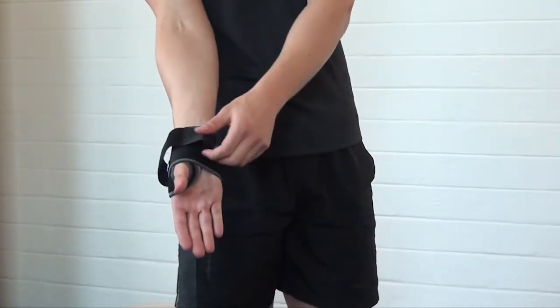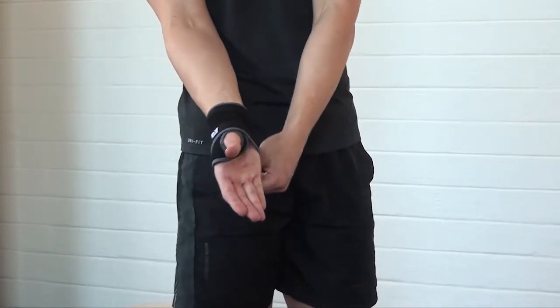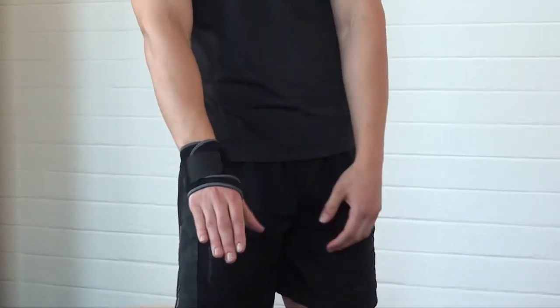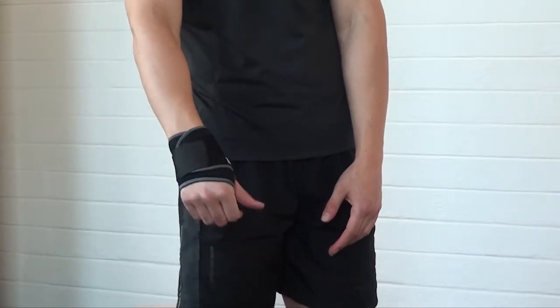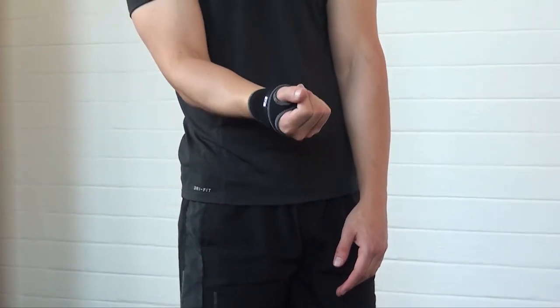Loosen the power band and then reattach to provide extra support to the carpal area. Have the patient flex the wrist and extend the wrist to make sure that it offers flexible, comfortable support.